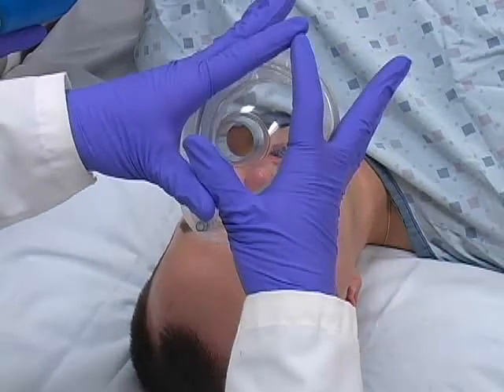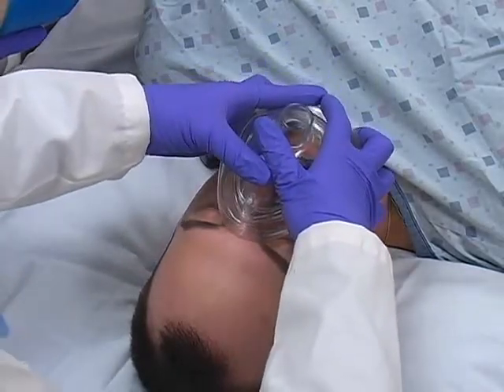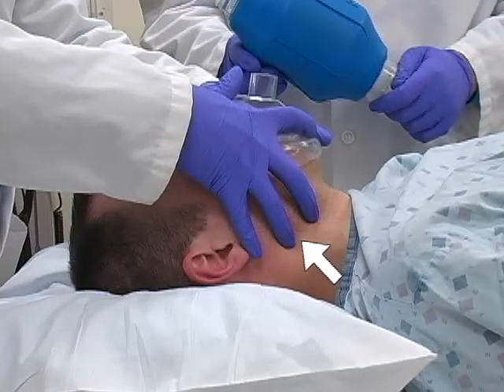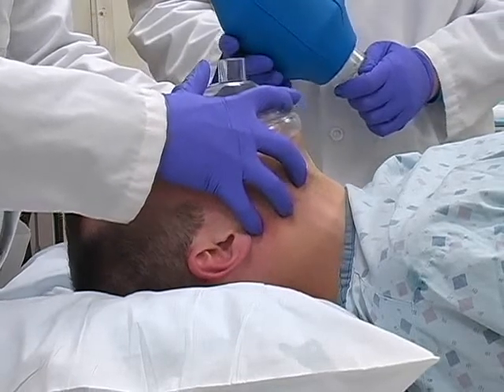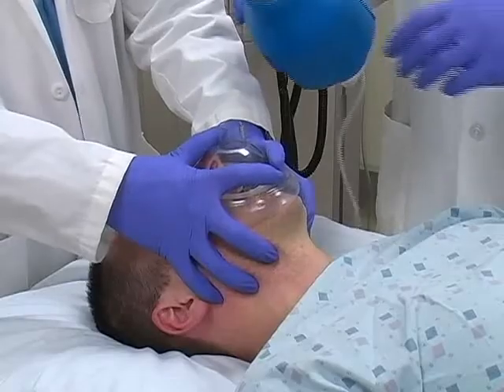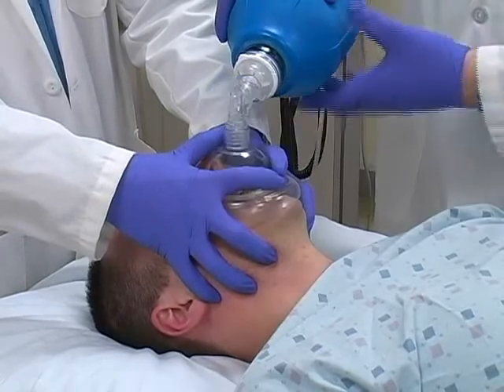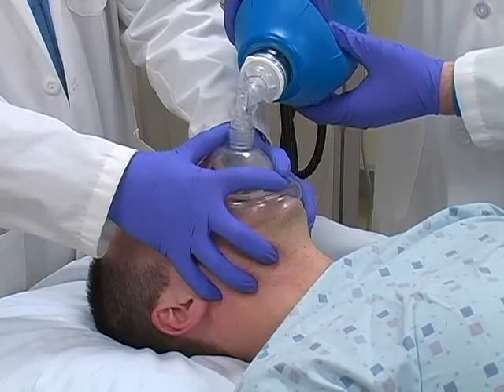The web spaces between the thumbs and the index fingers are placed adjacent to the connector stem, and then the mask is lowered onto the patient's face, nasal portion first. The middle, ring, and little fingers are placed along the underside of the mandible and pull the jaw anteriorly. The thumbs and index fingers hold pressure along the superior and inferior portions of the mask. Once a proper seal is achieved, the second provider attaches the bag to the mask and begins ventilation.